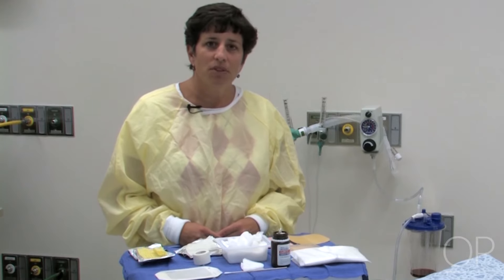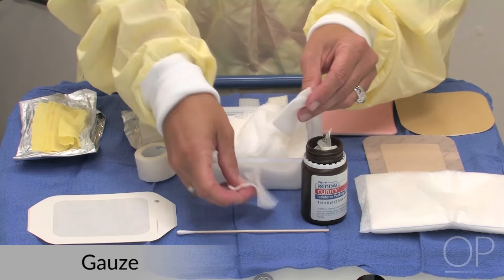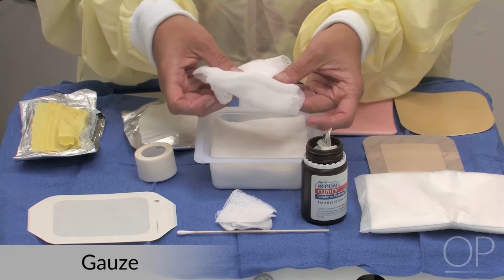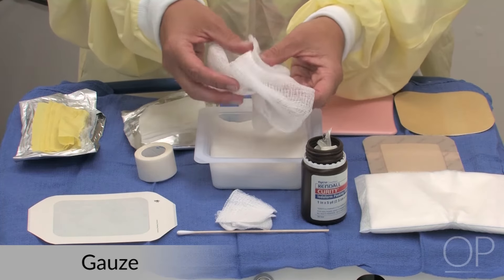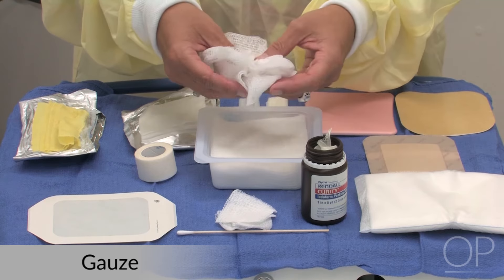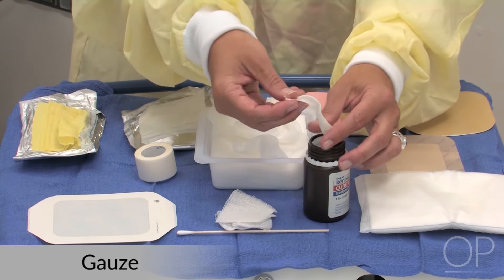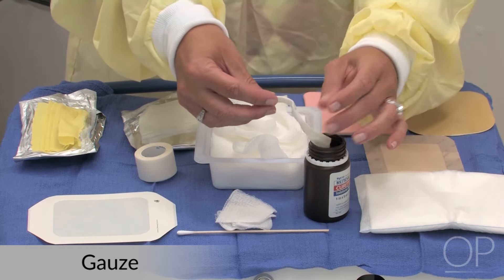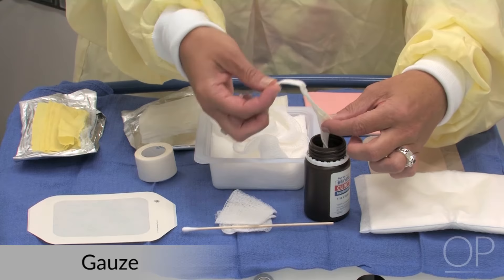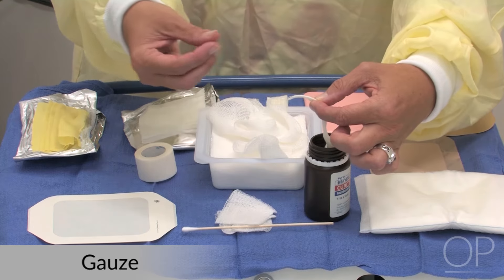Now I'm going to show you some of the wound products. We'll start with the more simple gauze products. You can use the 2x2 size — these can actually be opened up and placed into the wound. There's also 4x4 size, which, if they come folded, you can take and put into the wound in a fluffed position. The goal is not to stuff the wound full, but to fill it loosely to give some room for drainage and for the wound to contract in. There are also different types of packing gauzes, which are narrower for thin or deep wounds, and you can use a Q-tip to help move the packing into the wound. It's a good idea to know how much you put in the wound and to leave a small piece outside so that when you go to redress it, you can pull the gauze straight out.